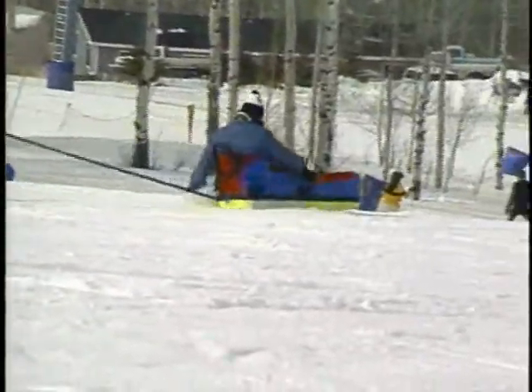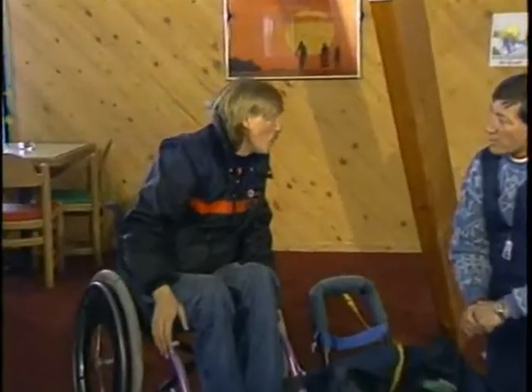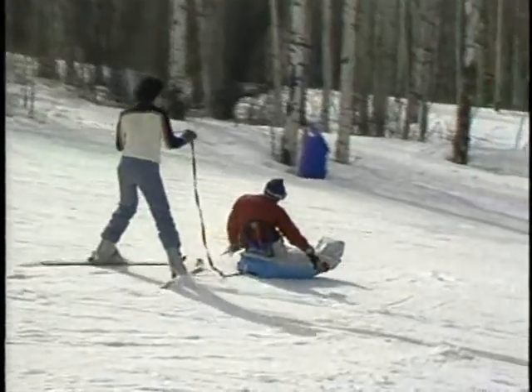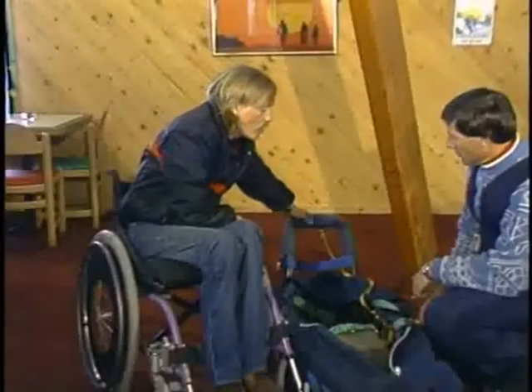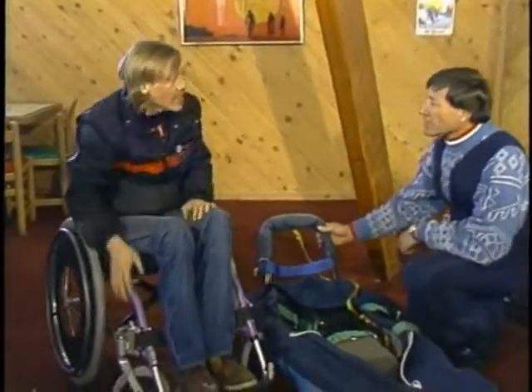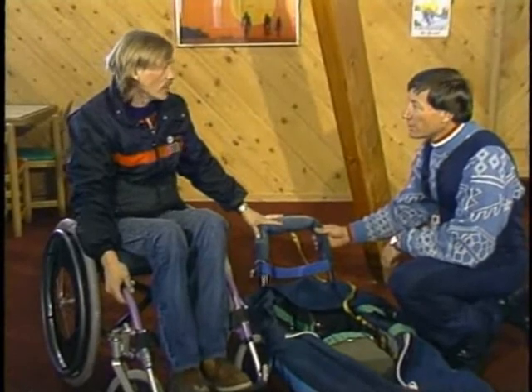If you get out of control and you know you're going to hit a person, a tree, anything like that, you got to learn to throw yourself over. When you throw yourself over, then you can tuck and roll. And you sort of just tuck and you can roll out of it. And it'll slow you down and prevent injury to you or somebody else. The sit ski is designed with important safety features. You got your roll bar, which is the big thing. So if you're out of control and you think you're going to wreck, then you tuck forward and you let the roll bar take the shock.